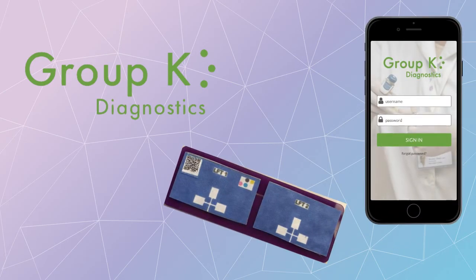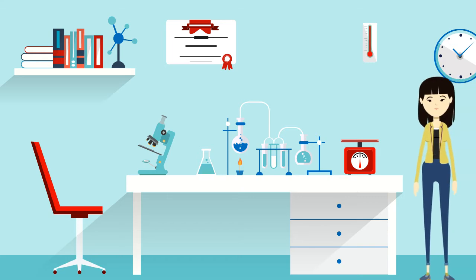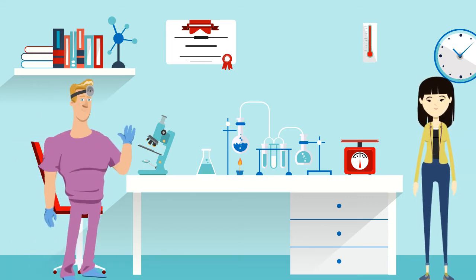Welcome to a demonstration of Group K's diagnostic system. Today, we'll be meeting with Dr. Steve, Nurse John, and patient Jane. Jane has come in for her quarterly check on her liver, as she has fatty liver disease.